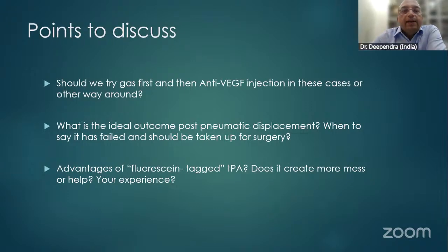I think this is a very interesting point: how should we judge the displacement? When we were trying to compare a few years back, we thought let's do it much more objectively and capture the blood displacement from the upper edge of the heme, how much it gets displaced. Now we have wide field OCTs also, but so far I don't think there is any study.